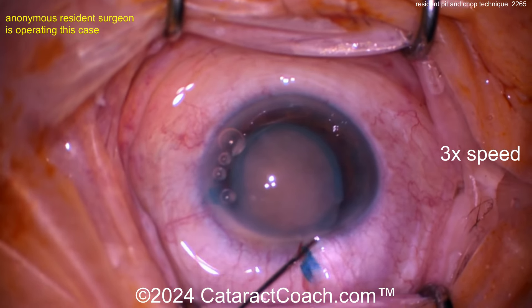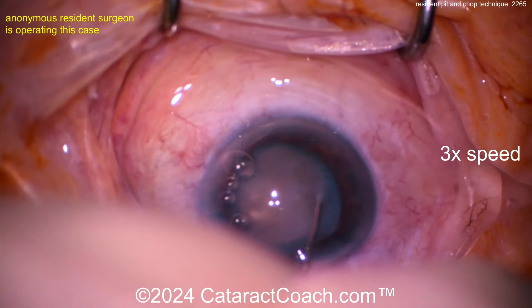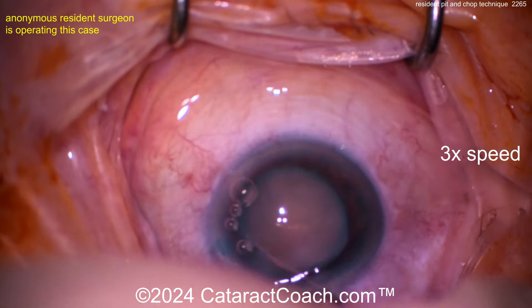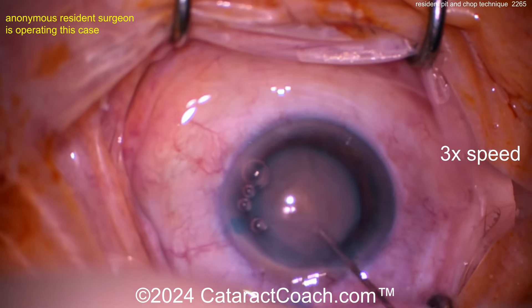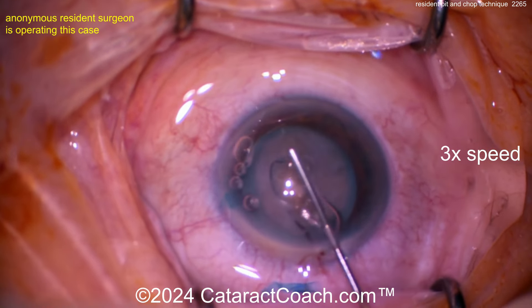Now letting a little viscoelastic out and being very gentle on the hydrodissection. The reason is you can't see the fluid wave — the lens is so opaque you really can't see the fluid wave at all. There it is, rotating quite nicely. I like that. We've sped the video up to three times normal speed.